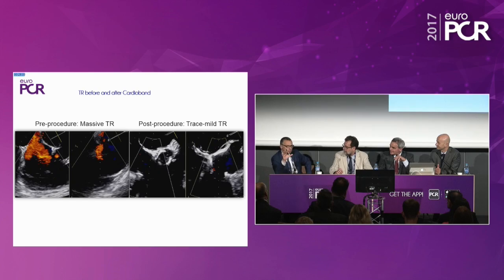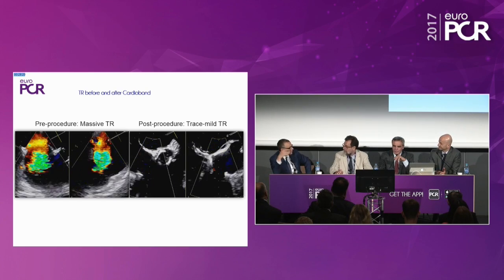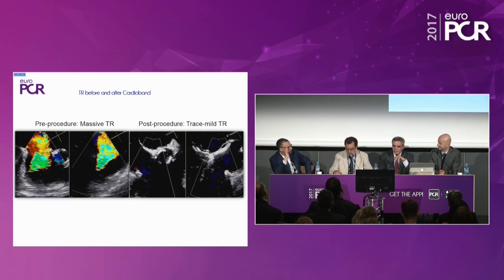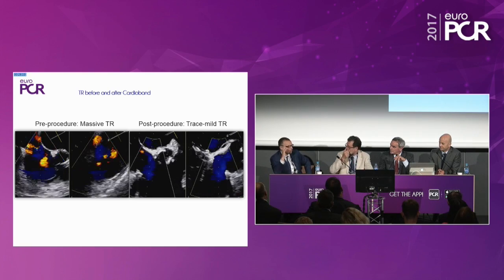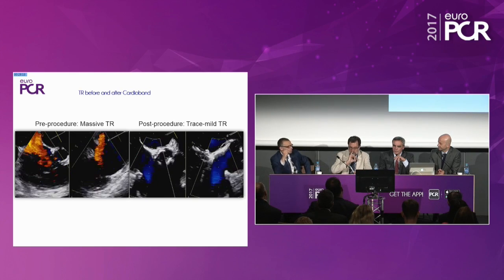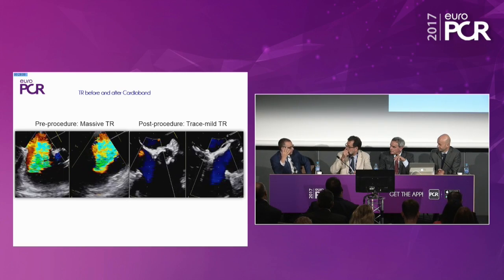I tell you what was my experience going from the left to the right for Cardioband. I did the first in man Cardioband tricuspid after some experience on the mitral. It took me 2 hours. You know how much it took for me the first mitral clip? 4 hours and no results.